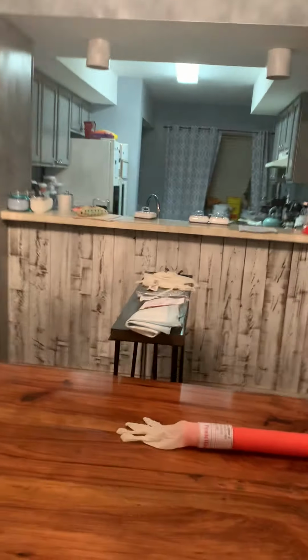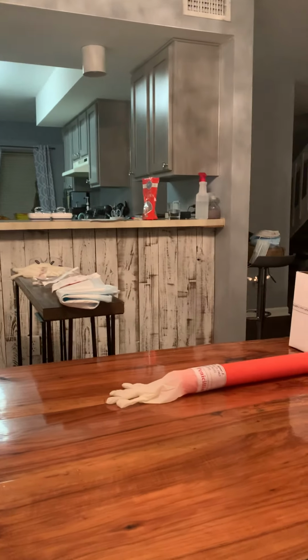Hi, my name is Kayla Campbell and I'm a student nurse here at the University of South Alabama, and today I'm going to be performing an IV insertion. Here's my ID and I will now scan the room. And place my camera.